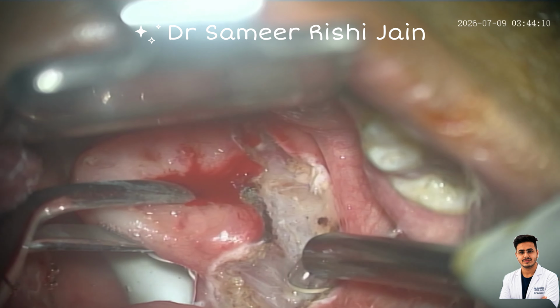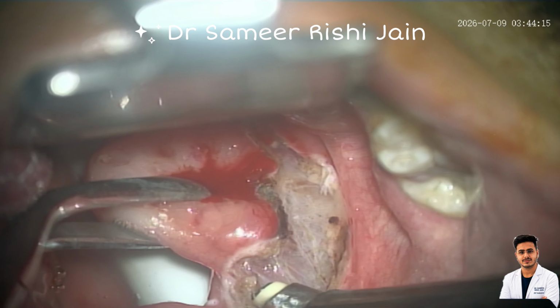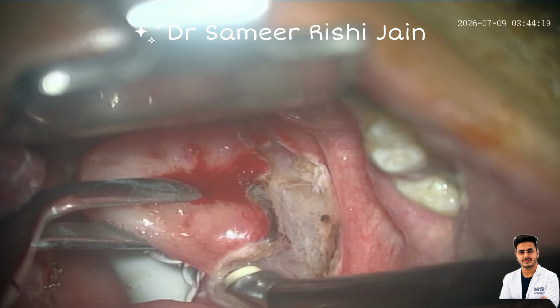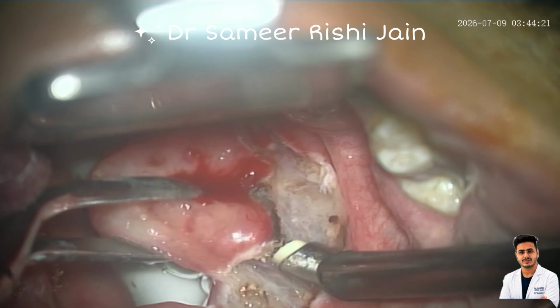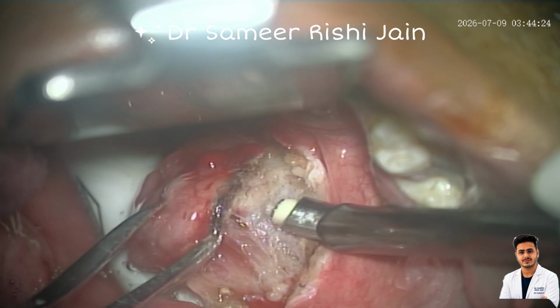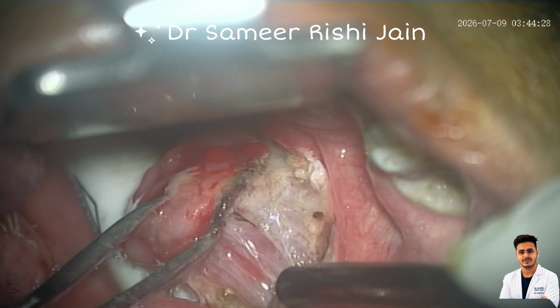As you can see, there is very minimal bleeding at the dissection because we are in the correct plane. We have to divide at the junction of the tonsillar tissue and the fibrous tissue. This will help us to be in the correct plane.